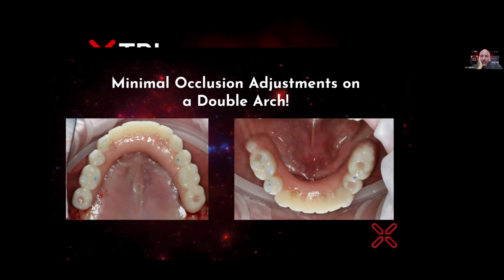I'm doing 50% freehanded. But nonetheless, time yourself of how long it takes you from the time the implants go in to selecting the multi-unit abutments, and they're screwed in and you're done. On average, it was taking me anywhere from 15 to 30 minutes, depending on how many implants I was placing, depending on how much time I was spending in terms of selecting the right height, selecting the right angle. So that selection process is time consuming. And what we see, docs, unfortunately, selecting the wrong height and selecting the wrong angle lots of times. And as a result, you end up getting access holes through the facial, which is not aesthetically pleasing.